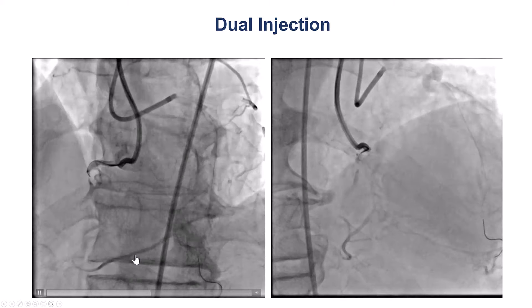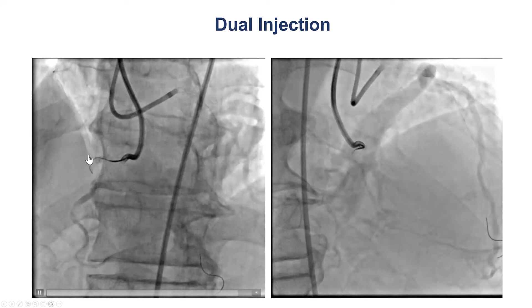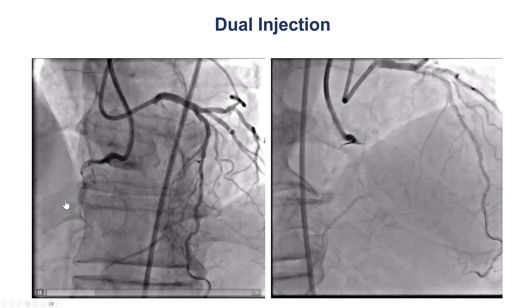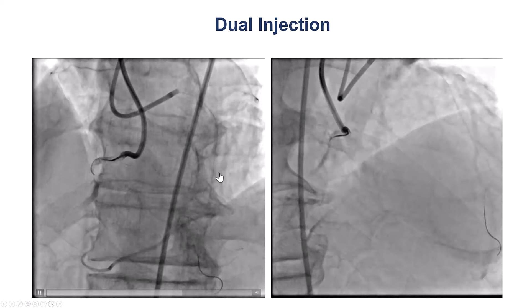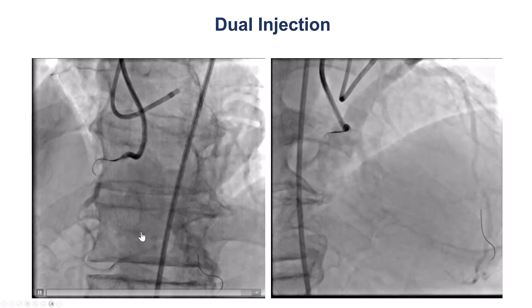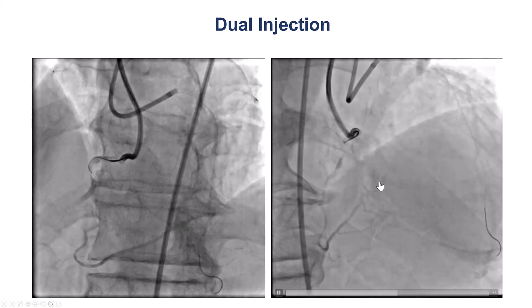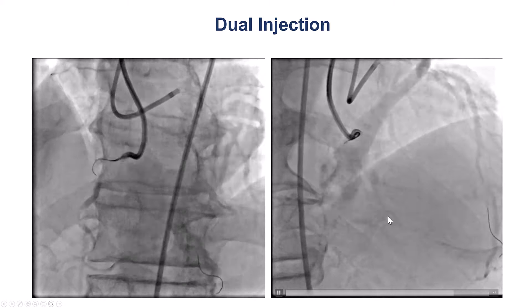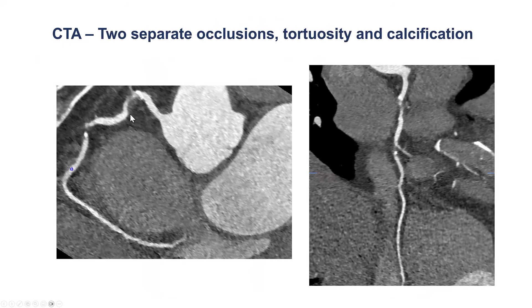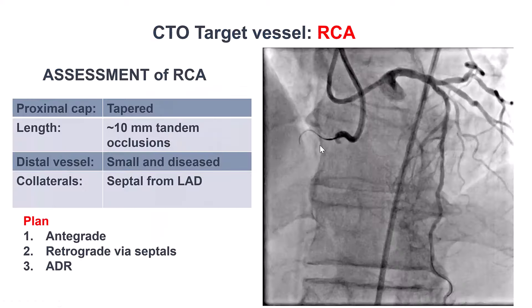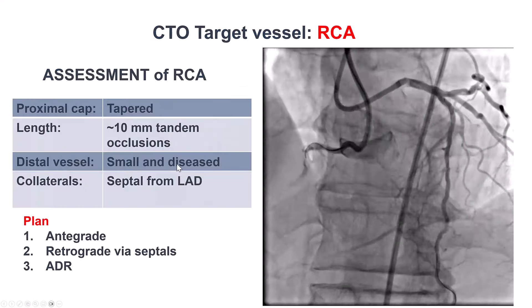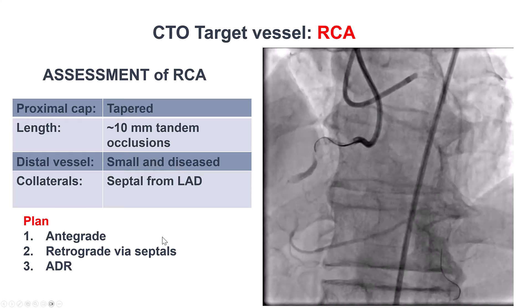This is a diagnostic angiogram. There is an occlusion of the proximal and middle RCA. No significant disease on the left. There are several collaterals filling a small PDA system as well as the right posterolateral. He did have a coronary CTA that demonstrated essentially two areas of occlusion, one in the proximal and one in the mid-right coronary artery. There was some calcium in the mid-right coronary artery. The occlusions were short, and the distal vessel was small and diffusely diseased.